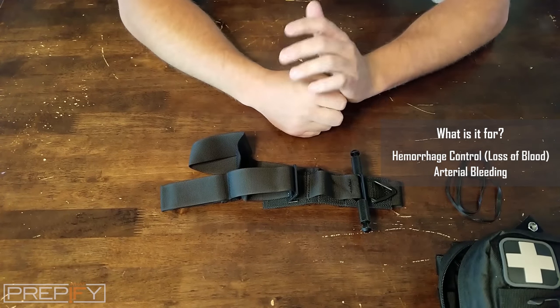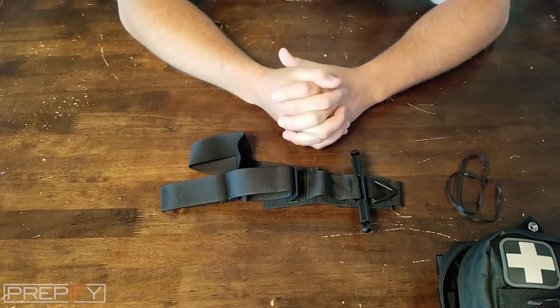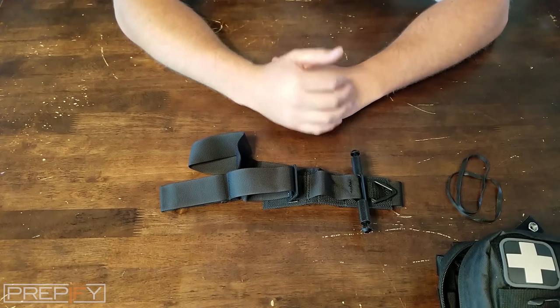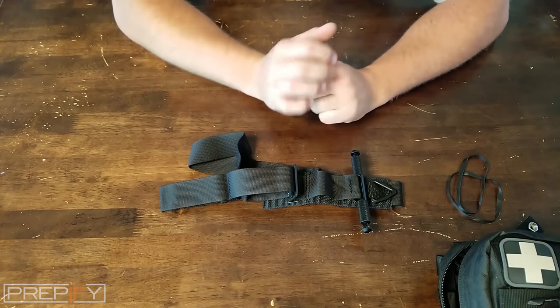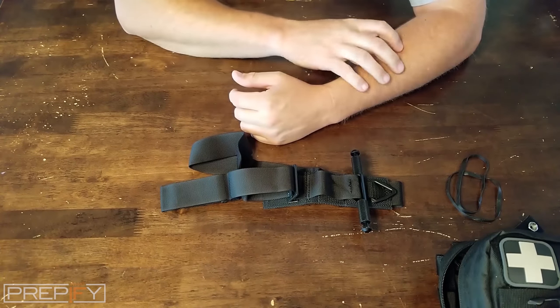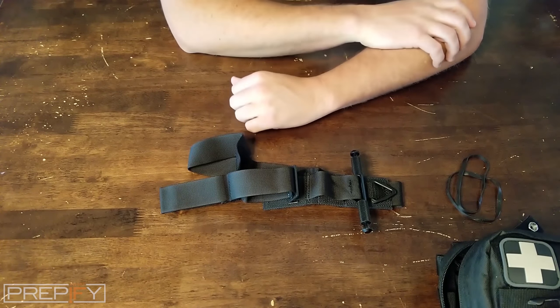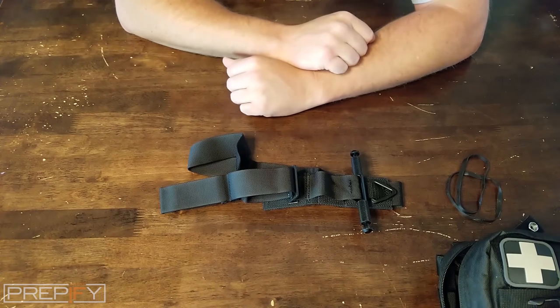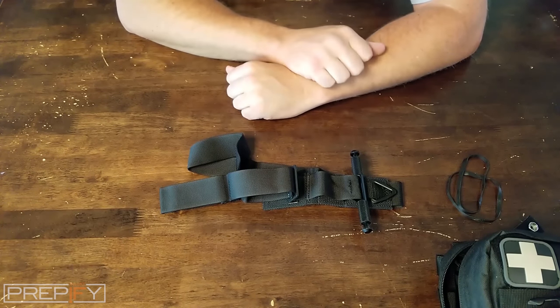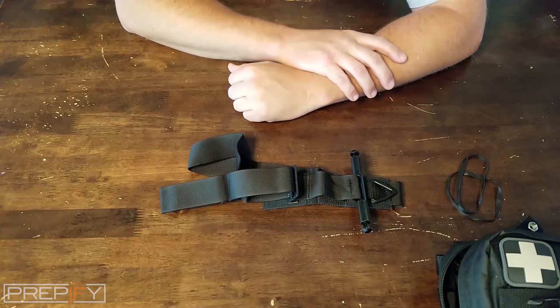If you just have a continuous oozing, that's not necessarily arterial — that's more venous bleeding. It's still dangerous, but holding pressure with a bandage will probably stop it. Arterial bleeding is harder to stop with pressure alone. The tourniquet can also be used to hold a bandage in place for venous bleeding — just put a bandage on, tighten the tourniquet down just enough to hold that pressure, and it should take care of it.